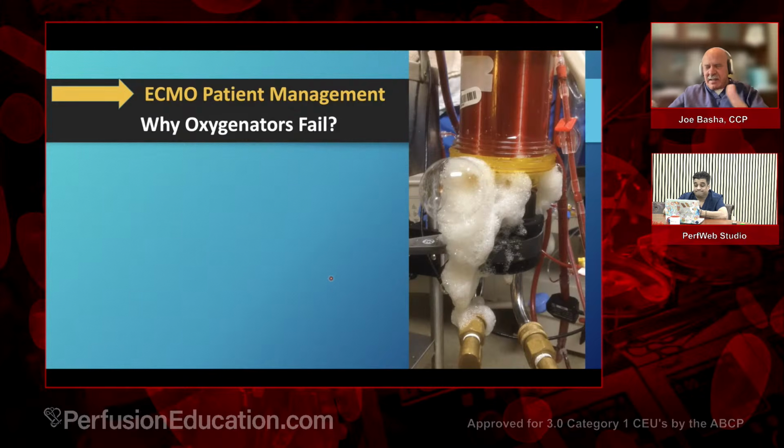That's why you see this. The polymethylpentene is a sheathed fiber, and it does not interact or react to lipids. You can use lipids in those, but this can occur without use of propofol in a patient that is just hyperlipidemic.